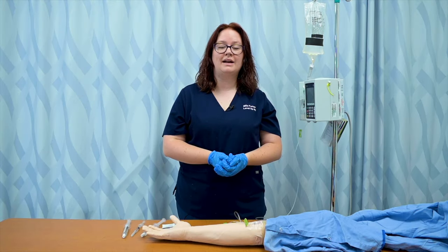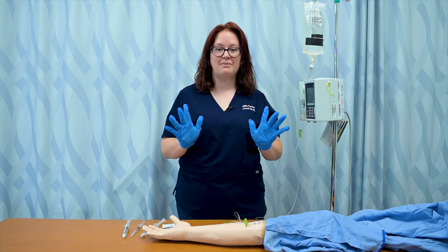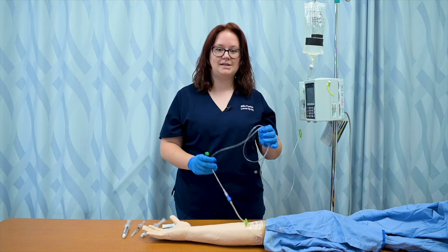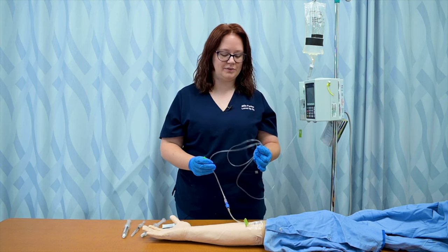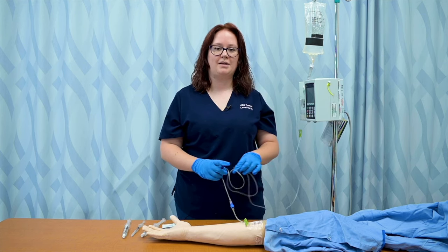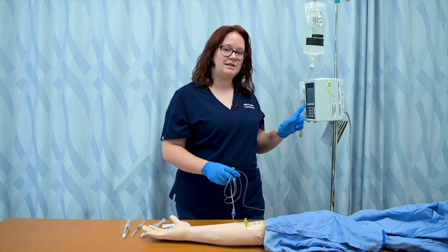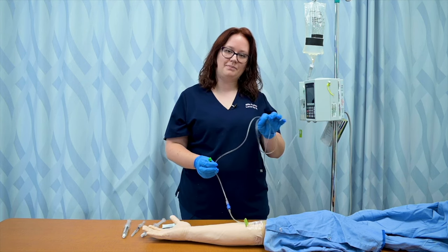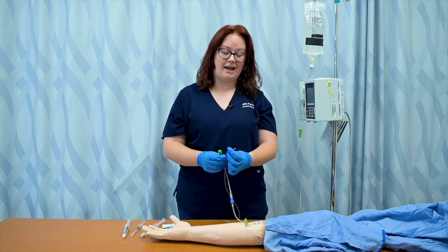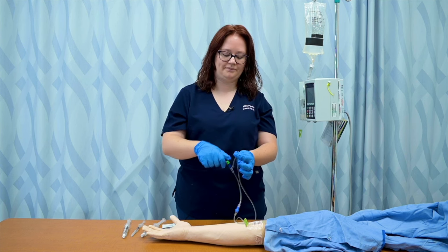Before I can give an IV push medication, I have already done my hand hygiene and got my gloves on. Now this IV push is going to be done with a patient who is connected to primary tubing. So they're receiving some type of fluid or medication. So that first step is to check compatibility between what's running and what I'm pushing. I then can pause my pump, and then if there's a clamp on this tubing, I can clamp it, or I can just fold it in half, so that when I administer the medication, it doesn't backflow up the line.